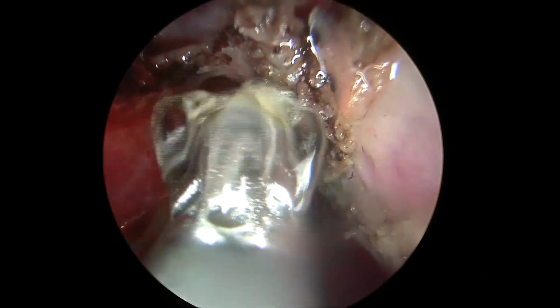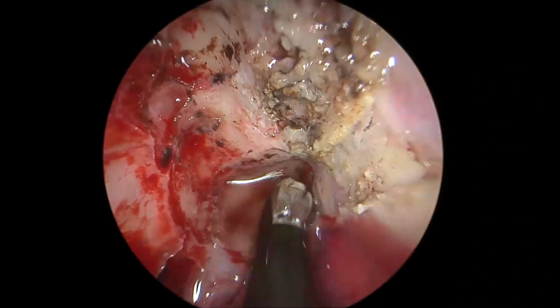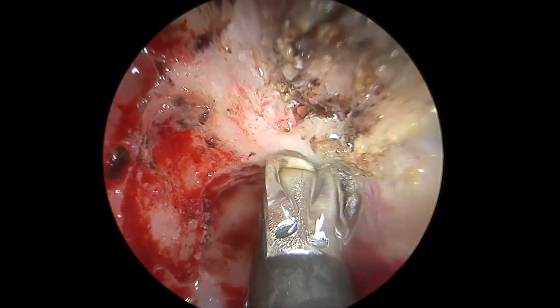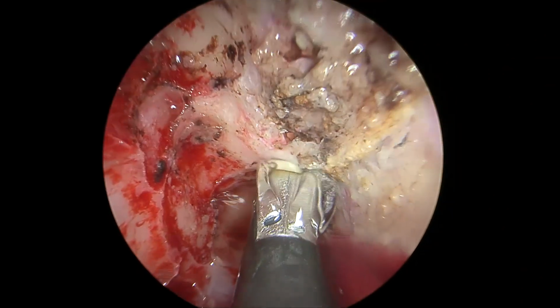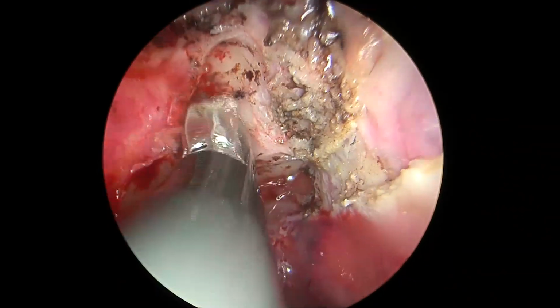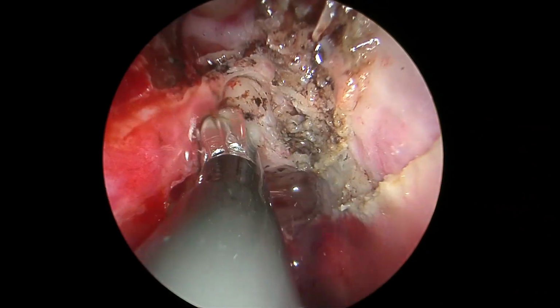You can see how the skull base defect has been very adequately isolated, smoothened, and excess tissue removed. And now with this done, you know that the exposure part is well taken care of. Now you come to the last and most important part, which is the graft placement.